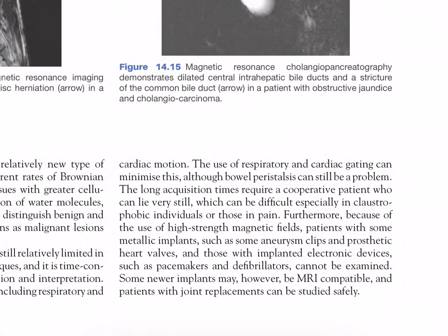Furthermore, because of the use of high strength magnetic fields, patients with some metallic implants such as some aneurysm clips and prosthetic heart valves, and those with implanted electronic devices such as pacemakers and defibrillators, cannot be examined. Some newer implants may, however, be MRI compatible, and patients with joint replacements can be studied safely.